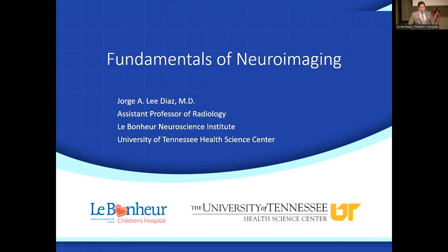I changed the title a little bit. Instead of saying basics, I'm putting fundamentals in neuroimaging. And it's because what I'm going to talk about is related to imaging of the brain and spine, but mainly trying to see different modalities to give you an overview of how we do this.